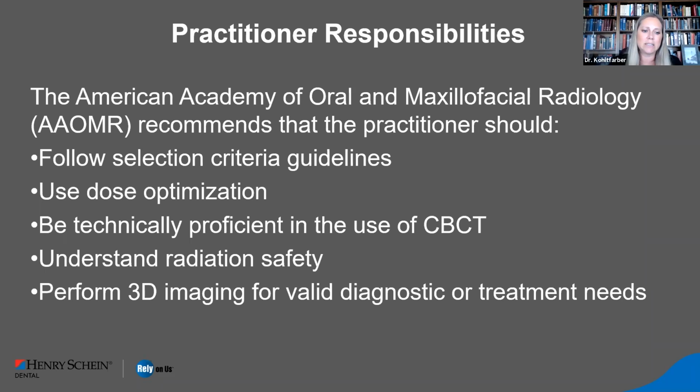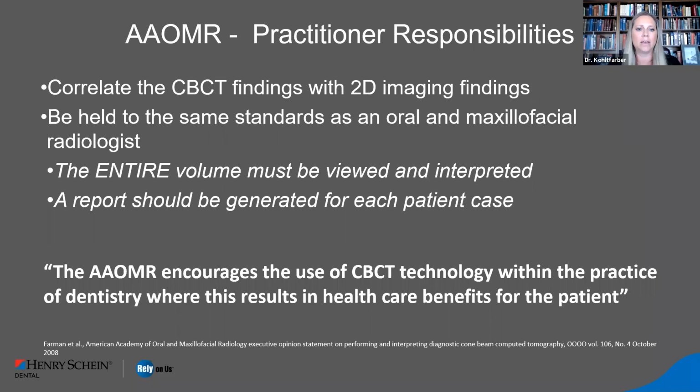But basically says be technically proficient in the use of CBCT. We need to understand radiation safety, which of course many of us do. We've learned this ever since we were in dental school, so this isn't new at all. And we need to perform 3D imaging for valid diagnostic or treatment needs. And we'll talk a little bit more about what that is.